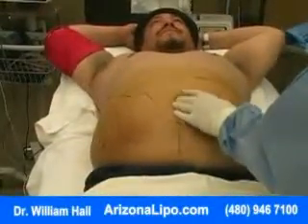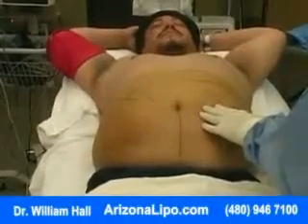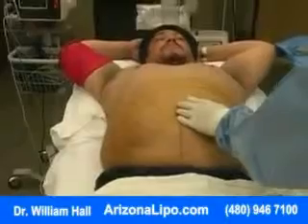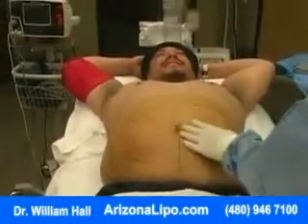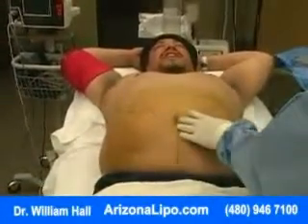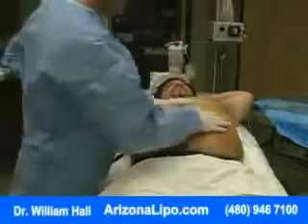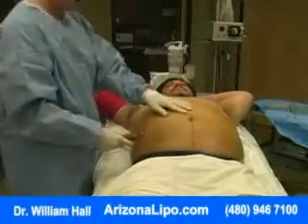I feel something. Yeah. There's not a lot of nerve endings in the fat component. That's why we can do this. It's like plucking hairs off. That's right. It's just a little uncomfortable at times, but it's never anything. Feels like just getting a shot or something like that. So right when we're done, we'll let it set up for probably 10, 15 minutes, and then we'll be able to start the suction.